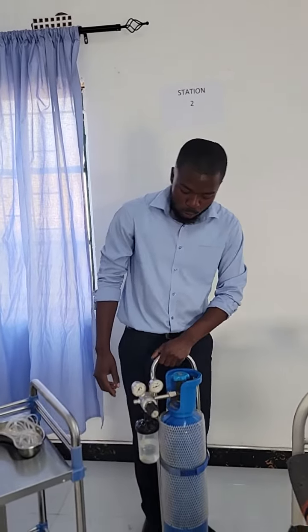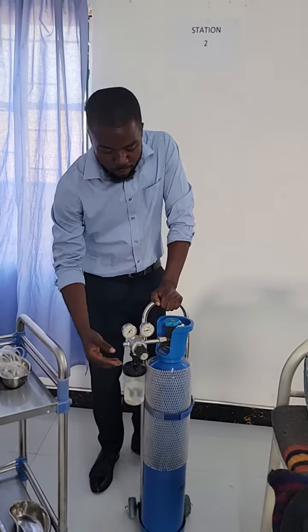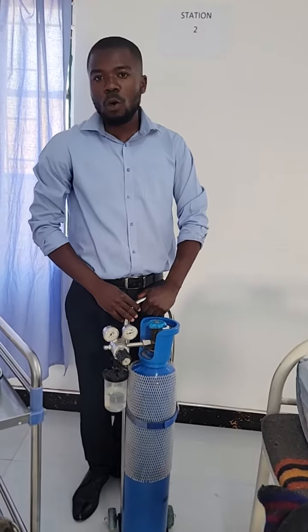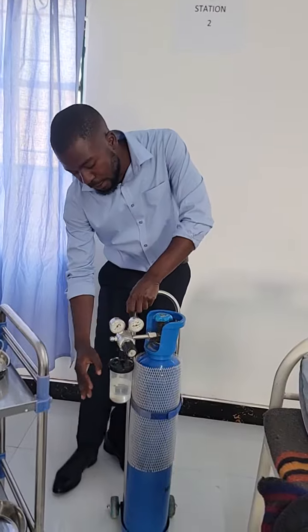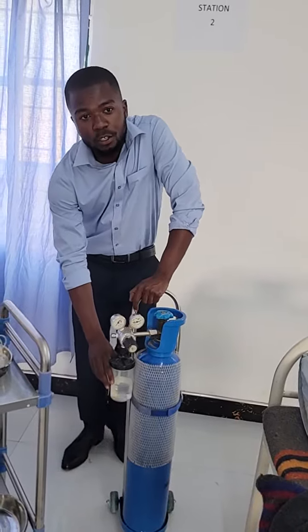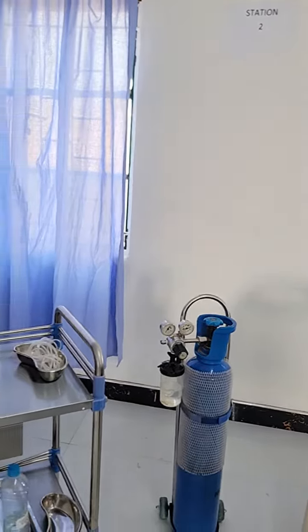We also have this part which is a humidifier. And then we have this black thing which is known as the flow adjustment knob. The humidifier is where you have to put distilled water.